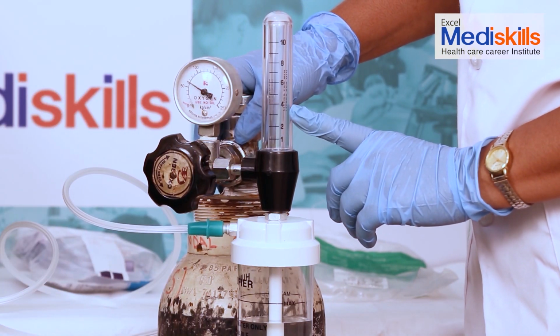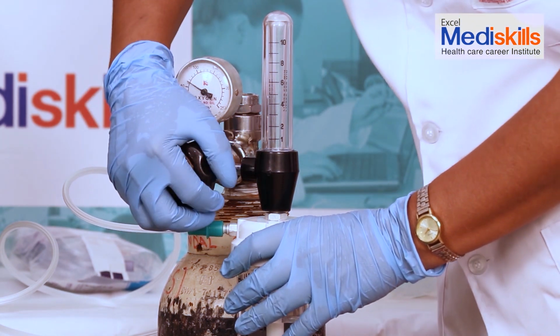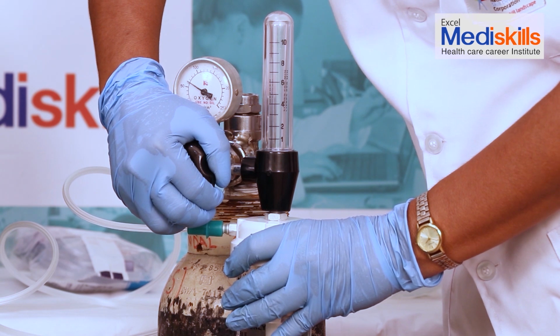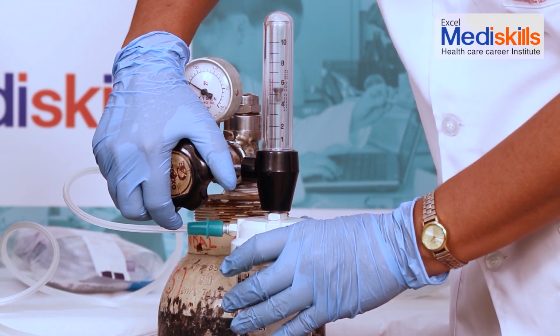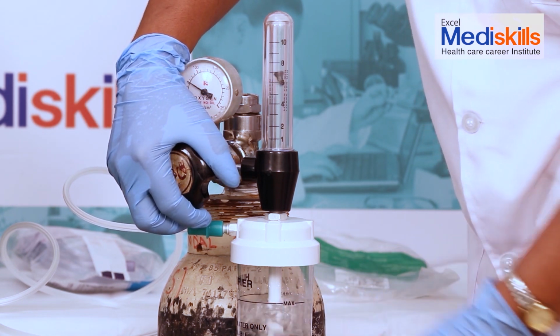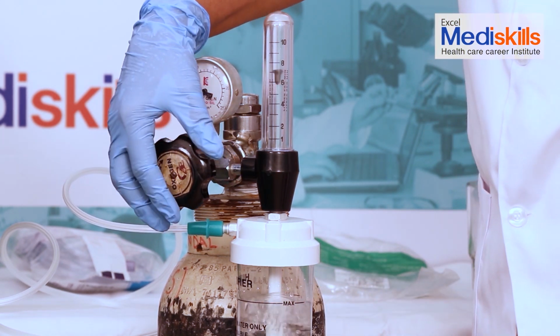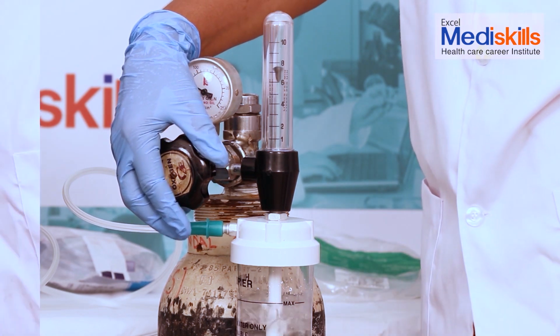We had earlier given 2 liters of oxygen in the cannula. But since the patient's breathing problem is not easing, we have taken oxygen in the mask and with the help of this regulator, we increase the level of oxygen. As you can see, the oxygen in the flow meter starts above 4. We can give oxygen up to 8 liters in the mask.